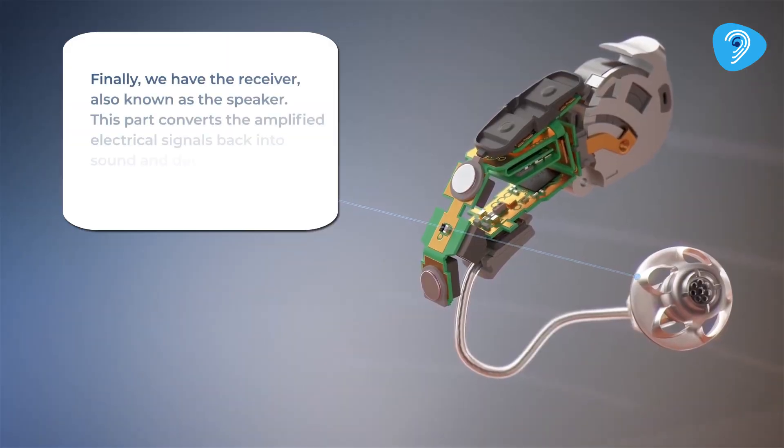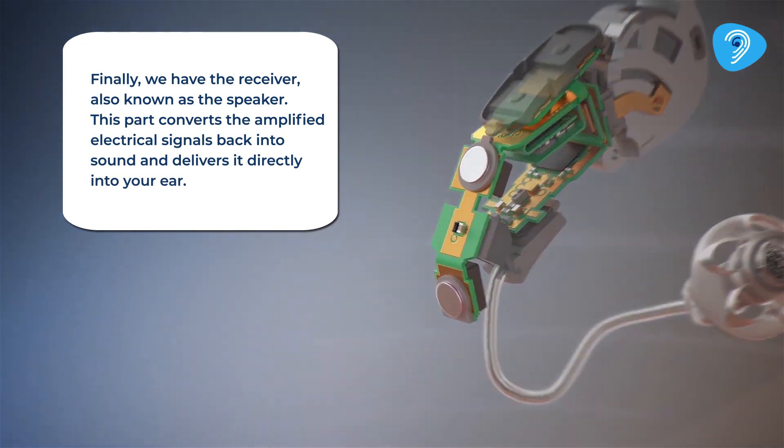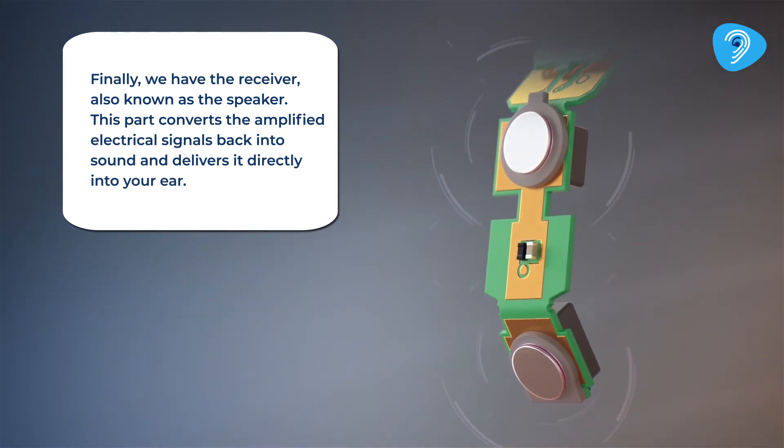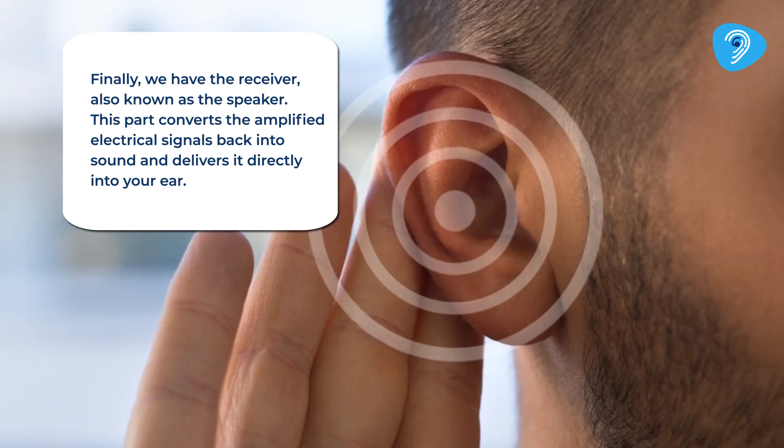Finally, we have the receiver, also known as a speaker. This part converts the amplified electrical signals back into sound and delivers it directly into your ear.